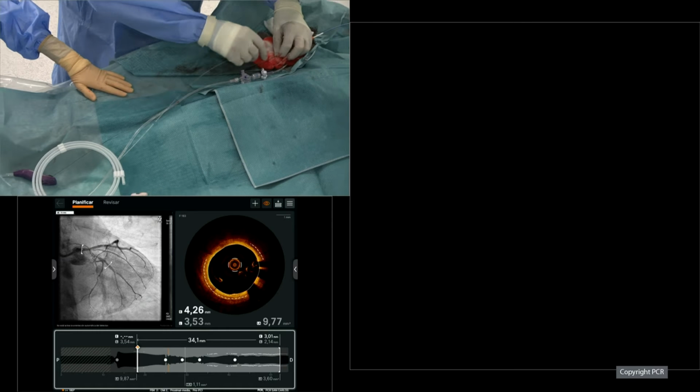Okay. So, Ewald, that's a question from the audience. Do you think there's consideration for the stent expansion capacity? Should you split it into 2 different platforms to be able to expand it adequately in the left main? You know, we measured the left main, and if we stick to the middle part of the left main, it's not such a huge left main.